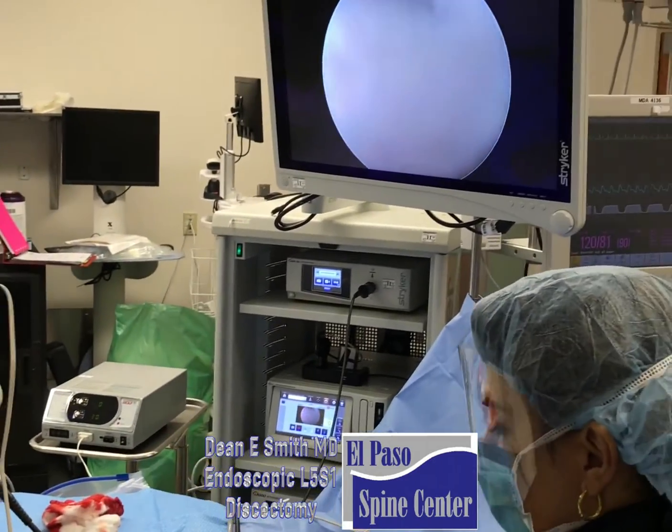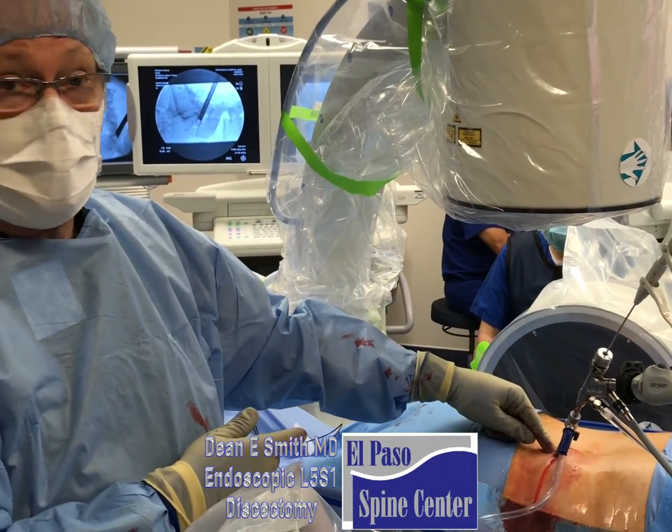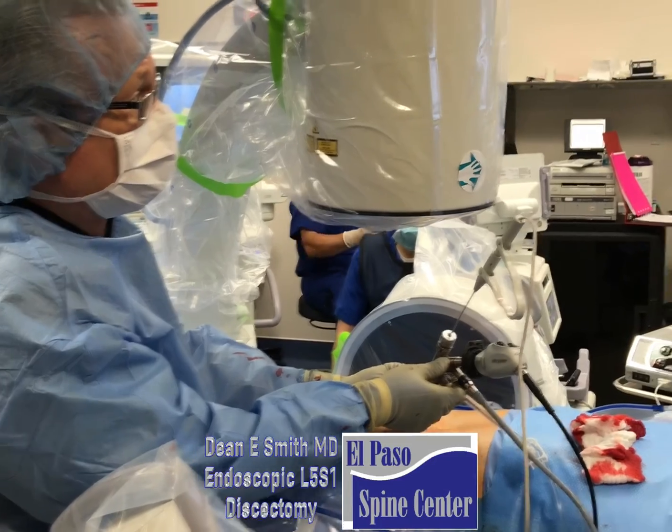Under a new name. We're doing a discectomy at L5S1. Here you can see the scope going into the disk space. Up here we can see the actual disk.